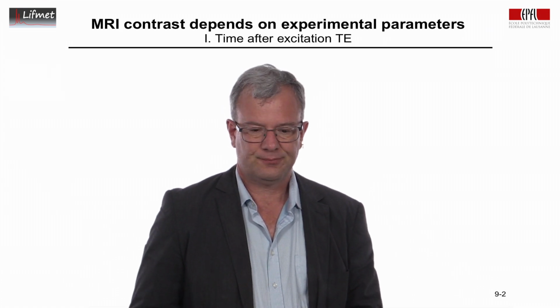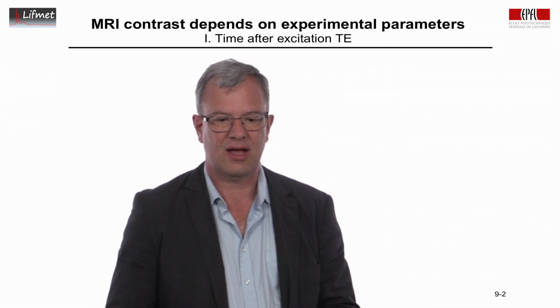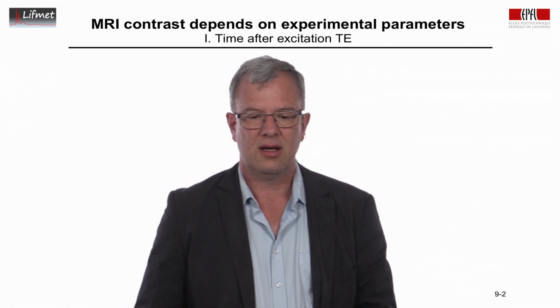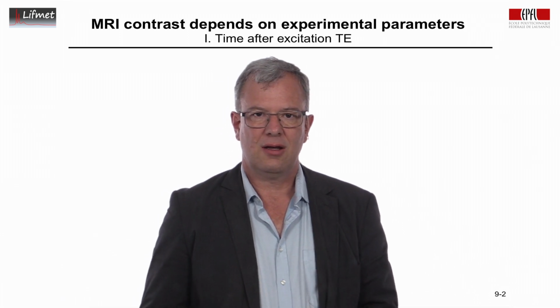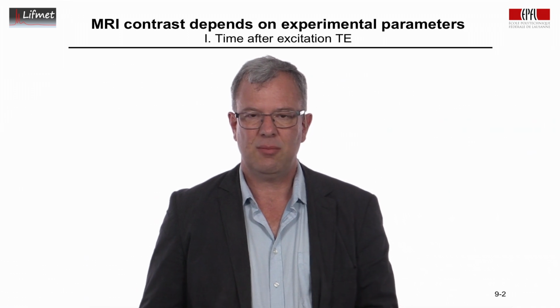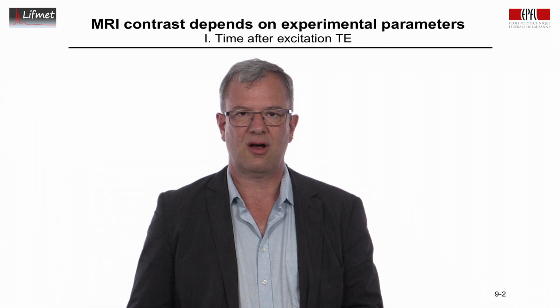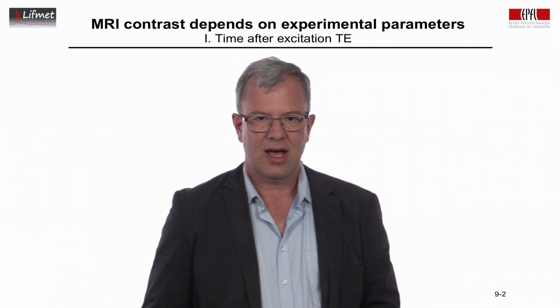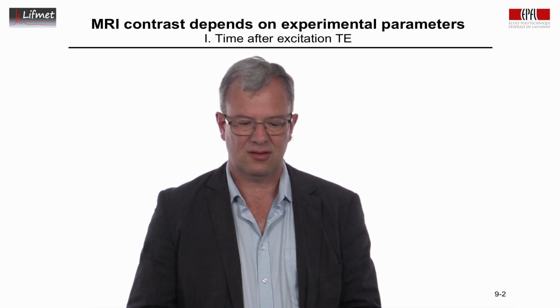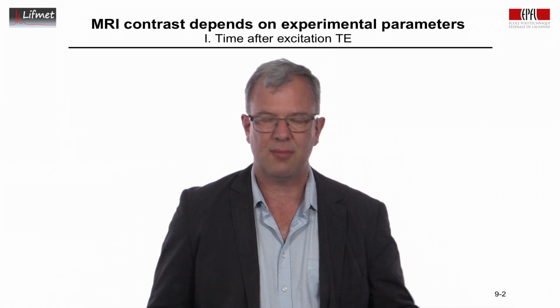And there is something that is different with magnetic resonance, and that is that the interactions between what we can manipulate on the scanner and how the image looks are far more diverse. The mechanisms are far more diverse. And so the point I want to make here is that the contrast strongly depends on experimental parameters.